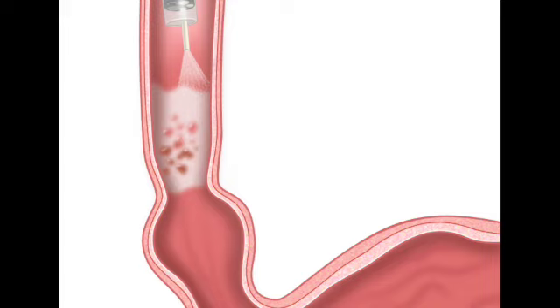Yeah. So that is our mission today. It's a great mission. We're going to unpack exactly how doctors use a basic household acid during gastrointestinal endoscopies to expose hidden, dangerous cells. Yes. Cells that the naked eye would otherwise completely miss. It's a perfect example of elegant medicine. Yeah. You look around a modern hospital suite and you see million-dollar MRI machines and robotic surgical arms, and right in the middle of all that high-tech gear, they're using a splash of vinegar to save lives.